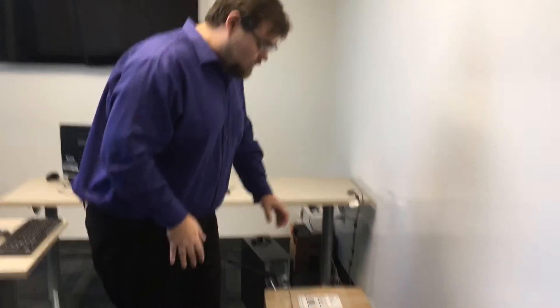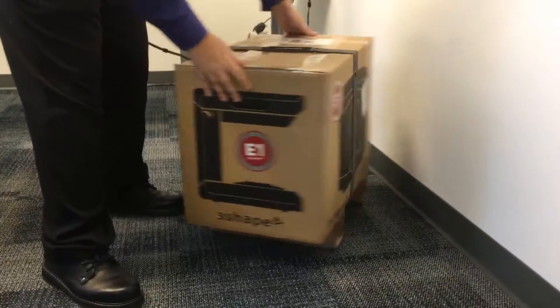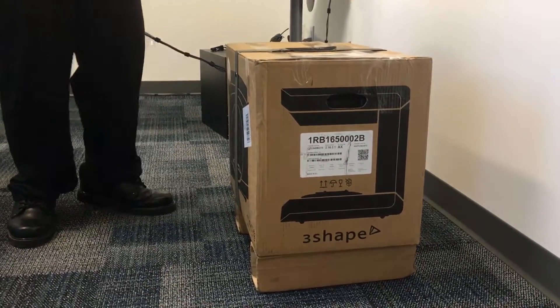Hi everybody, my name is Logan Woomer and I'm the Certified 3Shape Trainer for the Yarn Corporation. Today we're going to unbox the brand new E1 Scanner by 3Shape. Right off the bat, it's in different packaging — it's no longer in a big wood crate. It's in a nice cardboard box with imagery on the sides, it's strapped down, and it's going to be a lot easier to open than the older scanner.